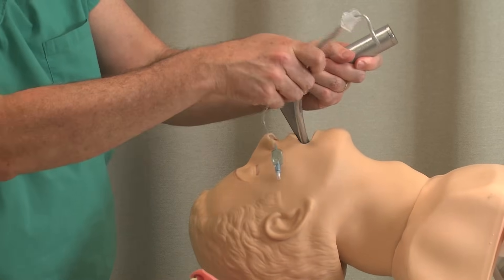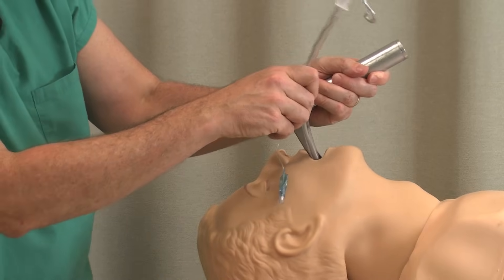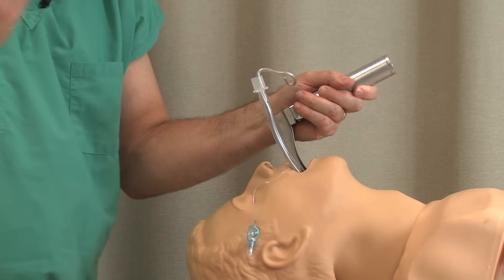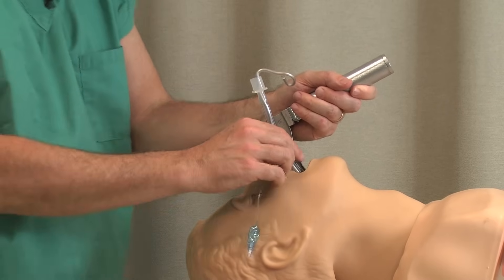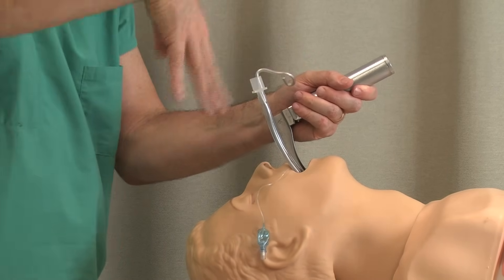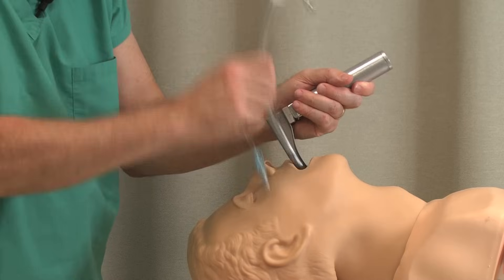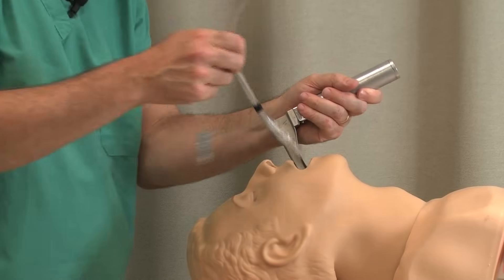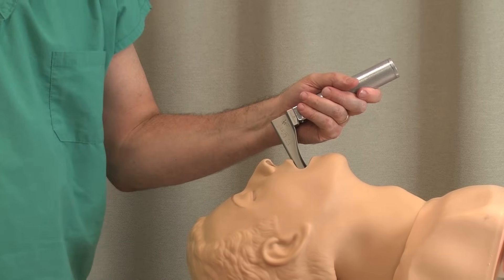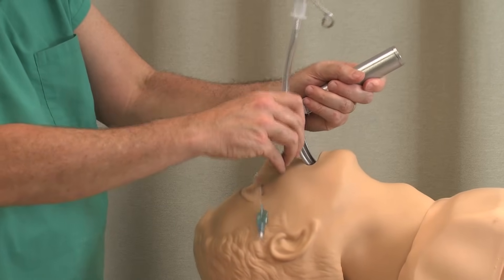I usually try to come in from the side a little bit so that I don't obscure my view, then slide it through the cords. Do you need a stylet? I would argue that you do. You need just enough curve to be able to make that turn. You don't want to be going boink boink boink — every time you do that, that's friable mucosa down there. It's very delicate vascular stuff. If I'm going like that a whole lot of times, I'm going to stir up a lot of bleeding, then it gets edematous, then it's hard to see, and you end up with a vicious circle. Try to be real, real gentle.